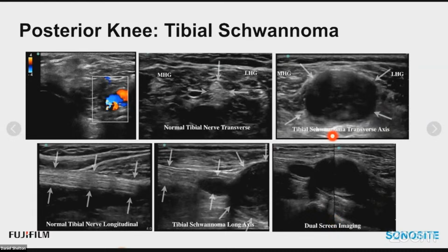So if we have a 50 millimeter transducer, as we do with the HFL 50 on our previous machines, and we do have on the L15 on the demonstration this evening, you can just split the screen and essentially bring your depth down, which is also good for perspective. Here's the posterior tibia and the posterior joint line. Basically what we're seeing here is a stitched together image that would be about 10 centimeters across.